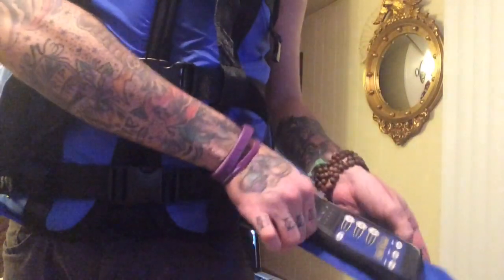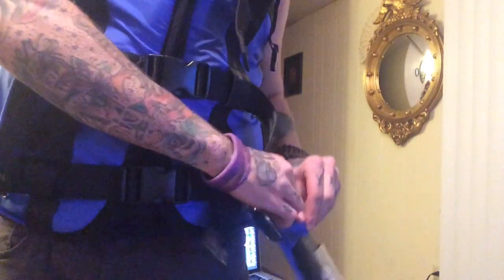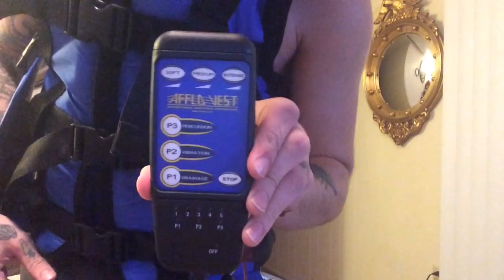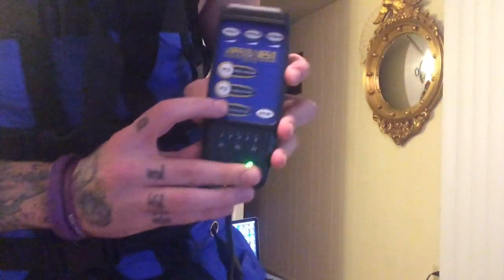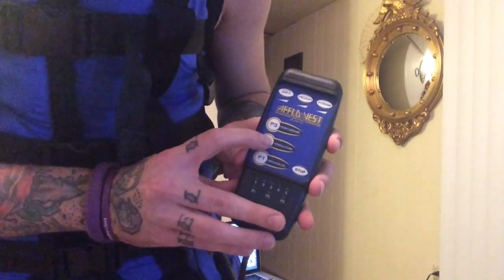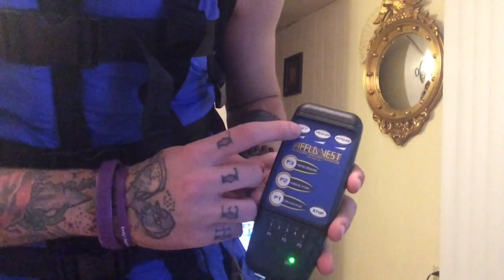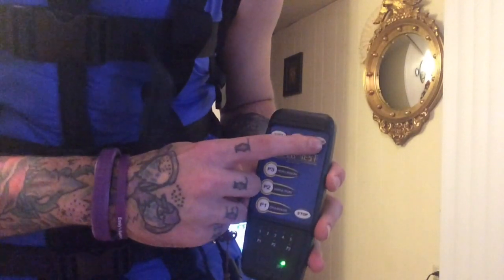So the actual switch that controls the Aflo vest — you have drainage, vibration, and percussion. And you have your intensity levels of soft, medium, and intense.